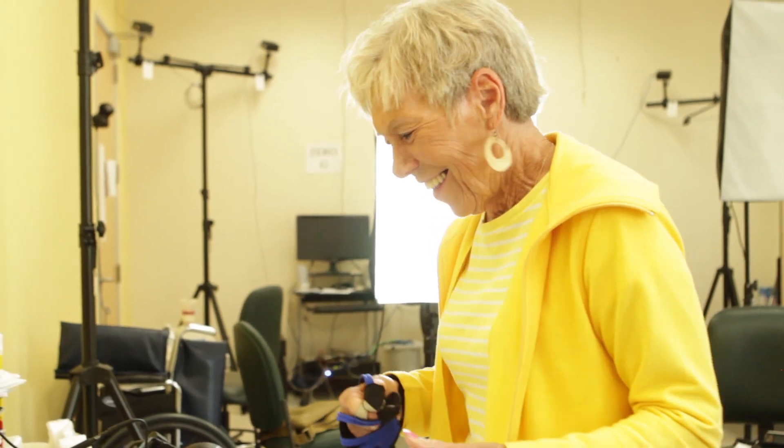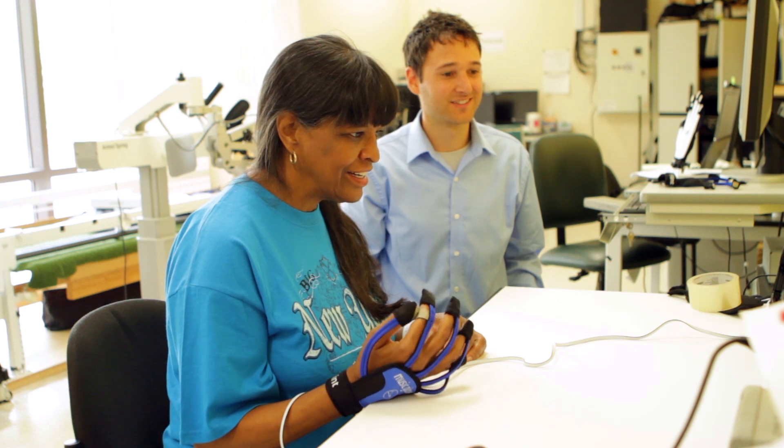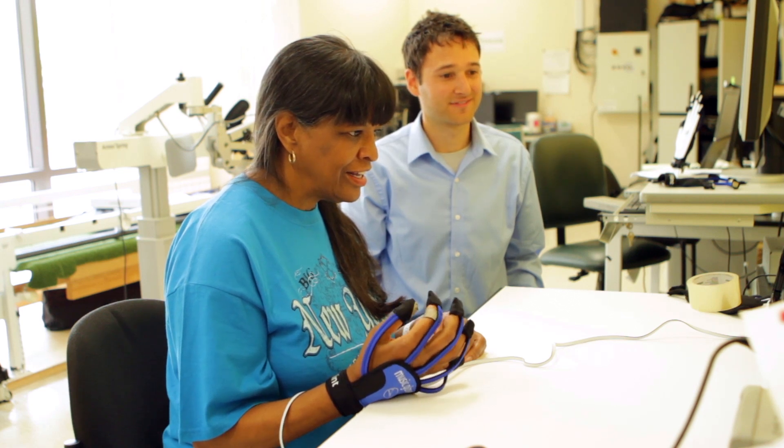I've never seen a reaction to a device like the Music Glove. Everyone who's tried it has really just enjoyed it and seen the benefit of it. I know everybody's different and every case is different, but on mine, that's been the best tool.